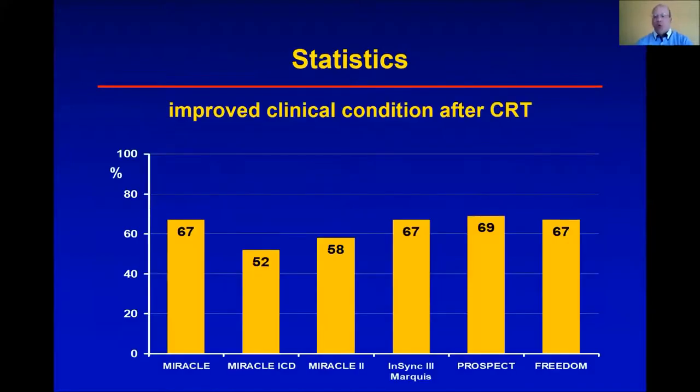The next topic where regional function analysis may be of interest is dyssynchrony. So we are talking about patients who are potential recipients of cardiac resynchronization therapy. And you know the problem there, that despite our ever-changing guidelines, we do not reach a higher success rate than something in the range of 60–70%. So most patients benefit, but there's always a third of patients that doesn't benefit from the therapy. And it's a costly therapy. It takes some effort. It's not without danger during the implantation. So it would be nice if we could select these patients better.